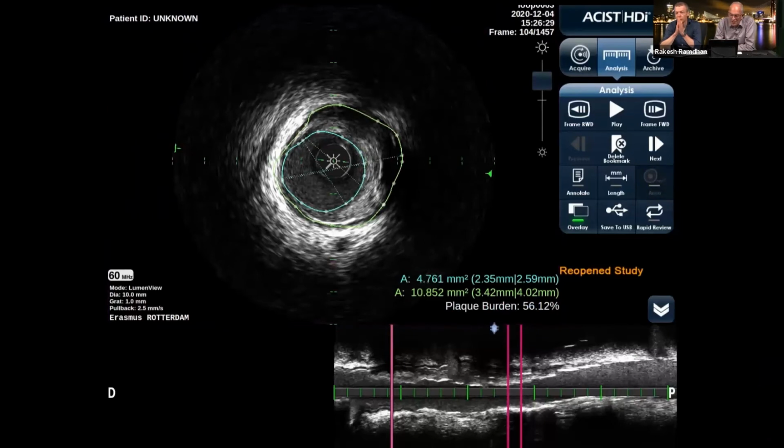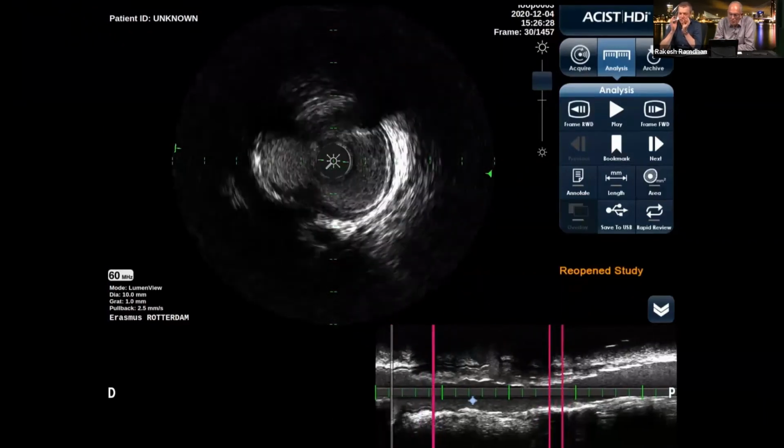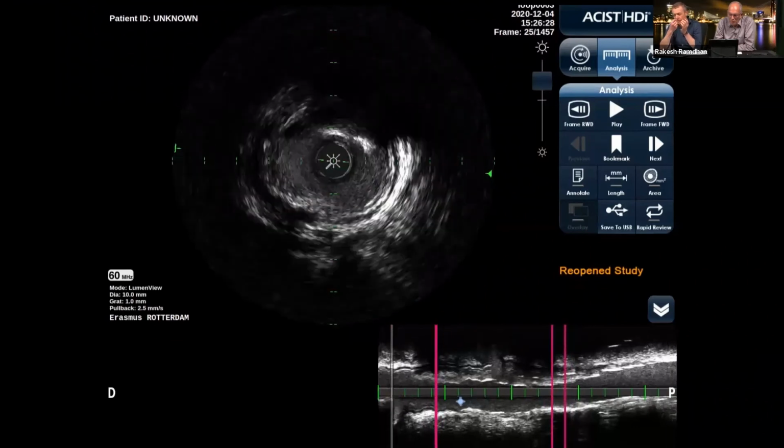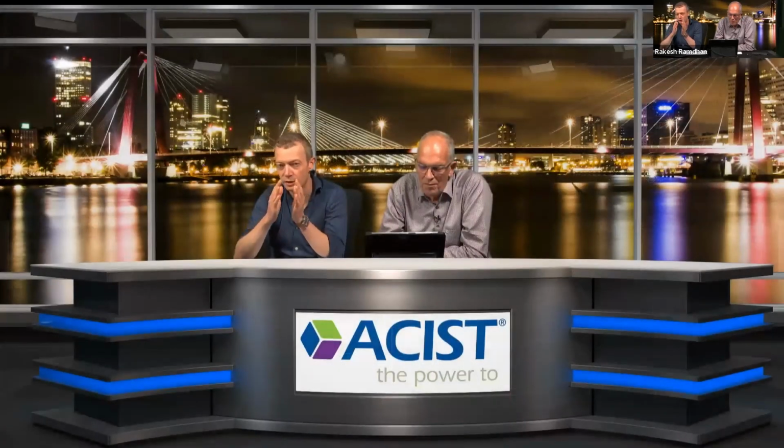And you might argue, well, the area distal is 4.7, your minimal stent area is 4.1, that is 87% stent expansion. Well, from a definition perspective that is perhaps correct, but this definition assumes that your distal landing zone or distal reference segment is a healthy segment in which the plaque burden is less than 50% and preferentially less than 30%.